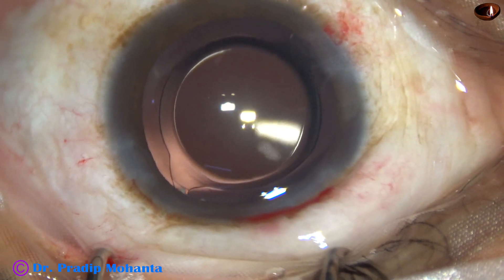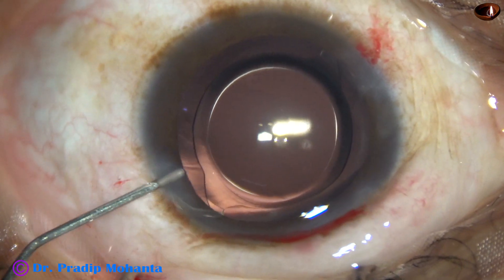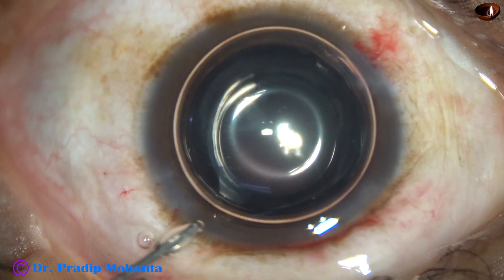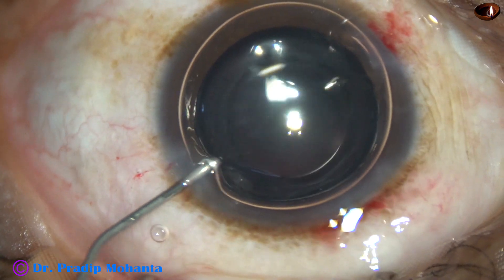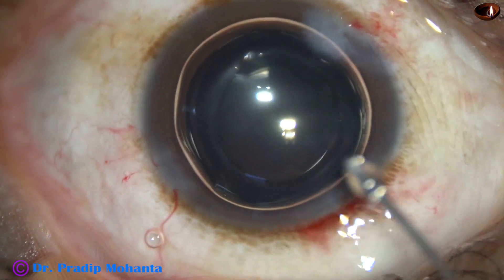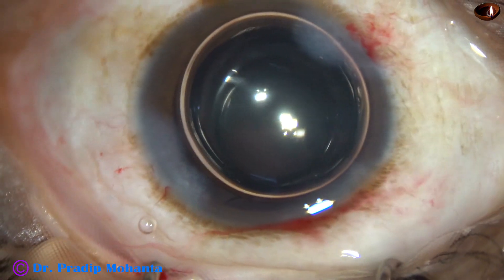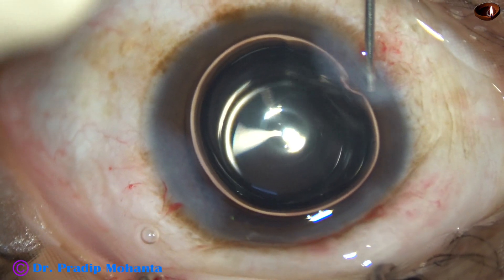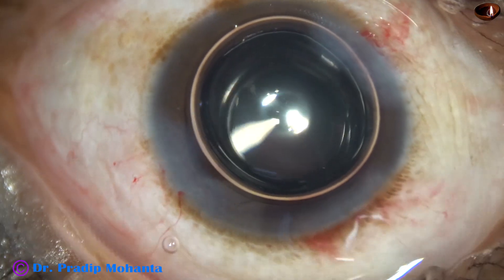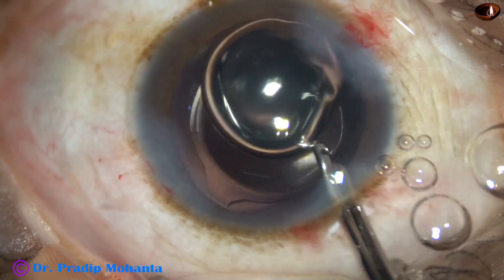This IHANS lens has an overall diameter of 13 millimeters. The optic is 6 millimeters. It is claimed to have extended depth of focus — it is not a multifocal lens, it is a monofocal lens with extended depth of focus. The patient will see intermediate objects quite clearly and distant objects even more clearly.